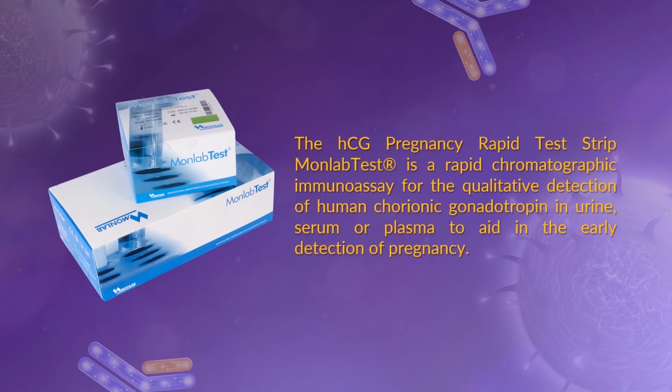The hCG Pregnancy Rapid Test Strip lab test is a rapid chromatographic immunoassay for the qualitative detection of human chorionic gonadotropin in the urine, serum, or plasma to aid in the early detection of pregnancy. This test can be used to see if a woman is pregnant. This hormone can also treat fertility problems.